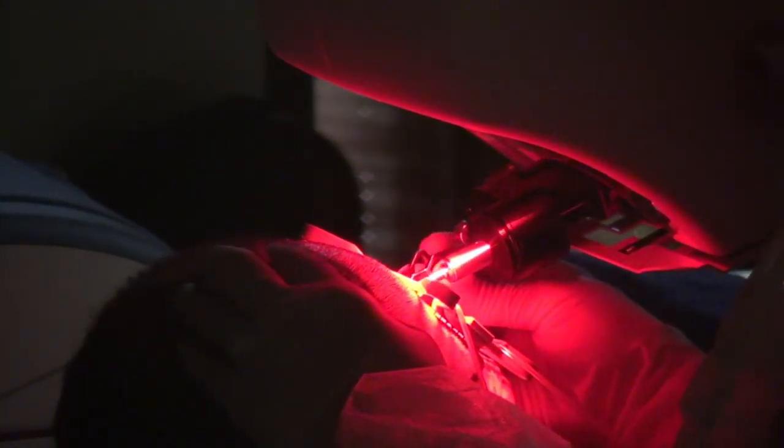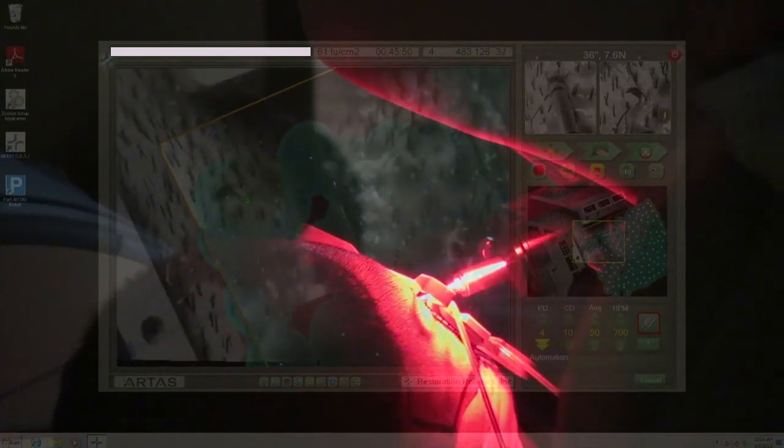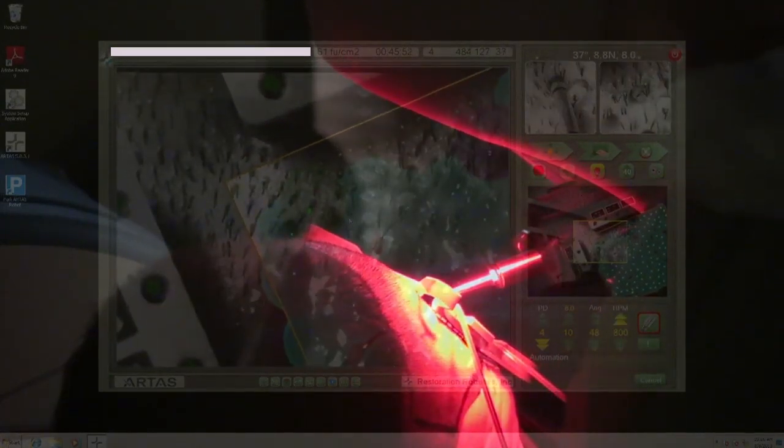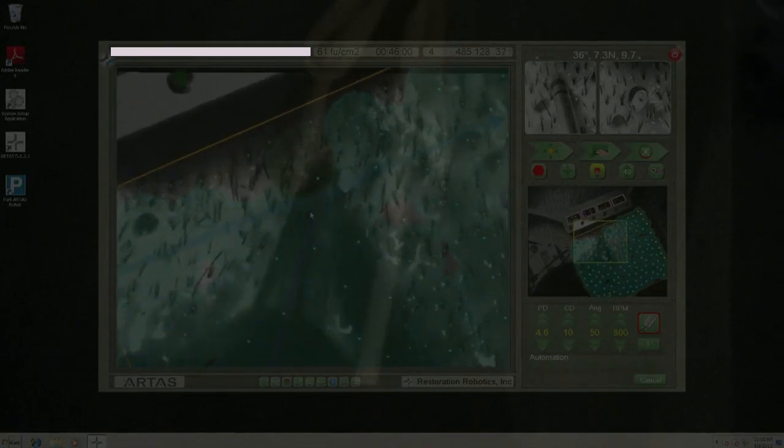And what we'll do is take all the grafts that were from this first hour. In about 15 minutes, we're going to take all those grafts, put them in one medicine cup, and put them in the refrigerator. And those will be the first grafts when we start to dissect or when we start to implant. Those will be the first that go into the body. Does that make sense? Yep.